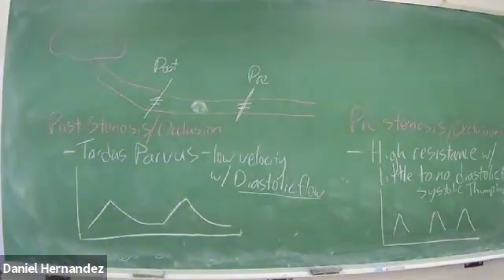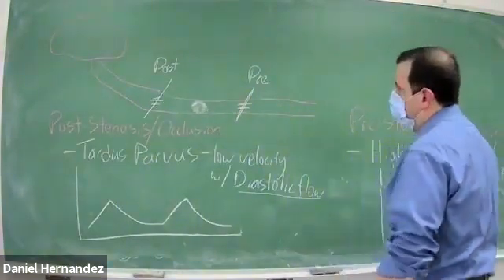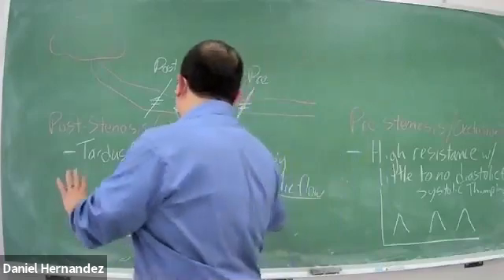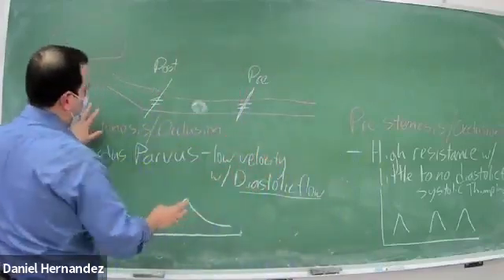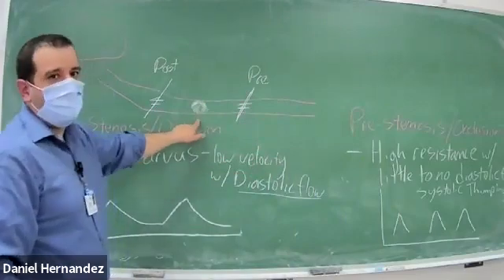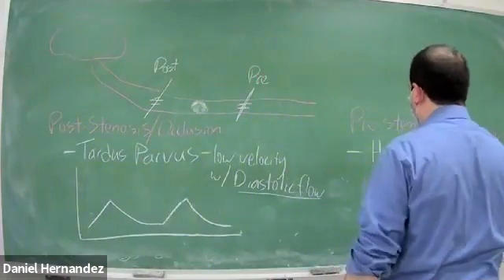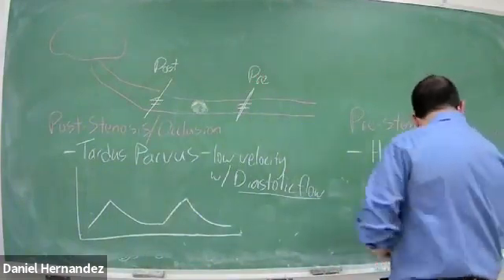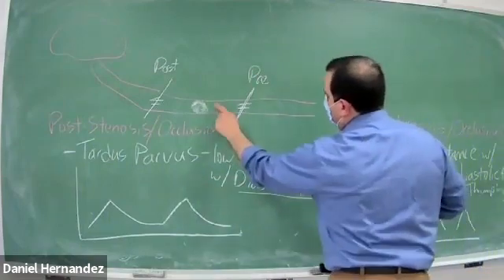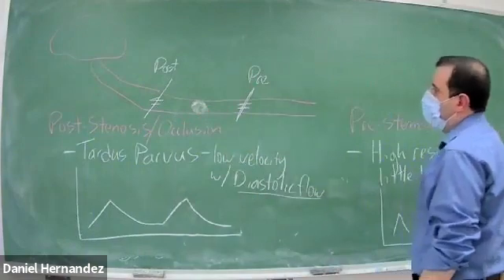And then to take it a step further, we can actually assess the stenotic lesion itself. So this is just a general overview of pre-stenotic versus post-stenotic. The doctors would then want us to evaluate what's going on in that stenotic lesion. So that's when our carotid ultrasounds become very important, because they want to know exactly how stenotic that lesion is, how severe, and what the velocities are at that particular point.